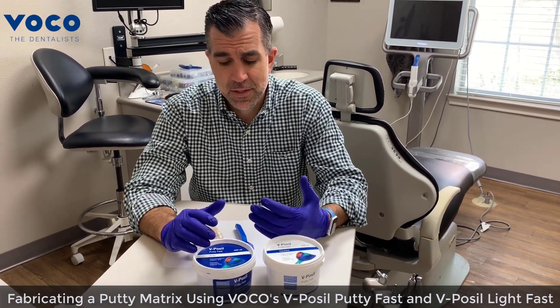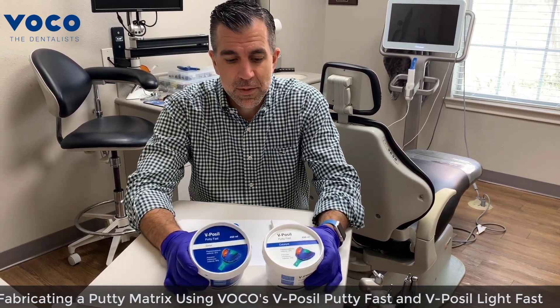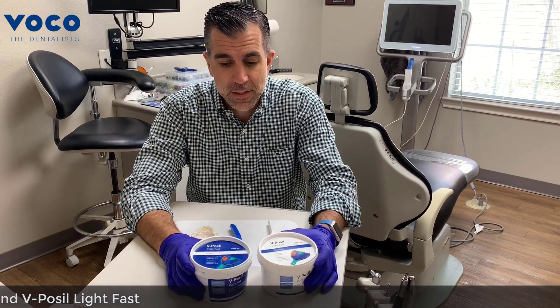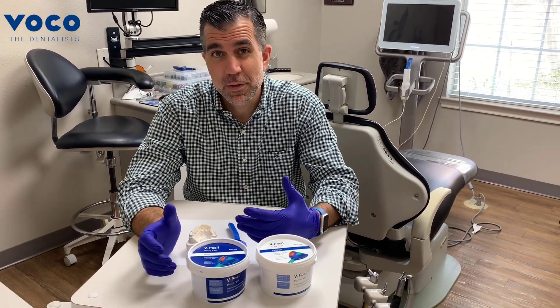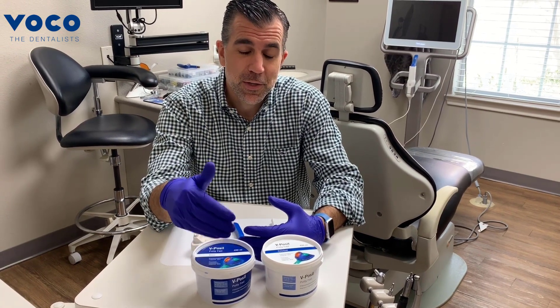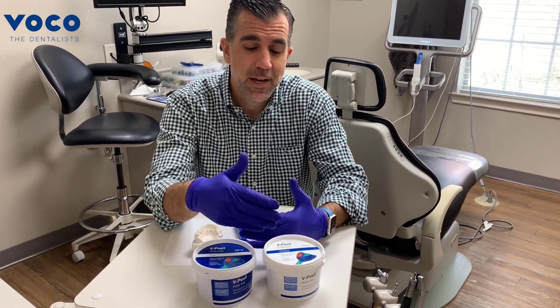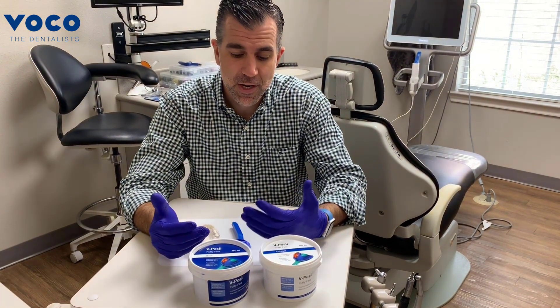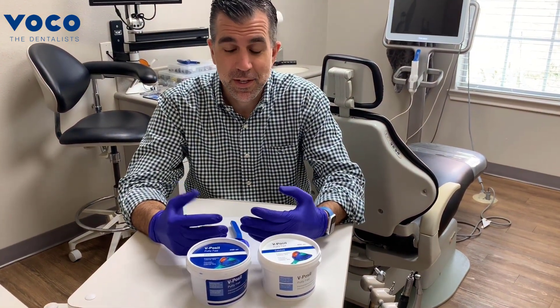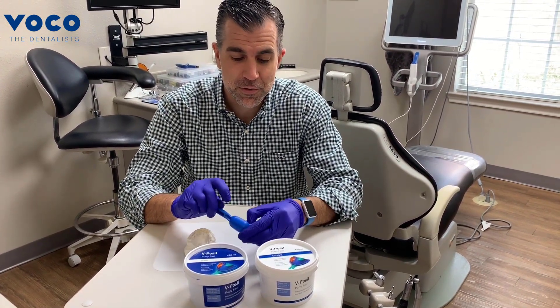I really like putty matrices and I really like the hand-mixed putties. This is a VPS putty from VOCO that we're going to use today called V-Posil Putty. It's really important that when you order these putties, they are both for intraoral and laboratory use. The intraoral is an addition reaction and the lab-based is a condensation reaction, so it's really important that you use one that will be okay for intraoral use.